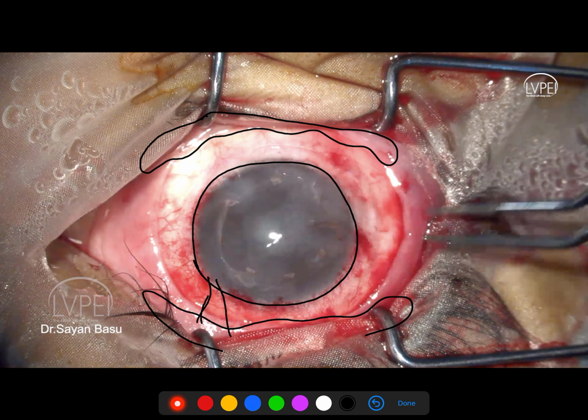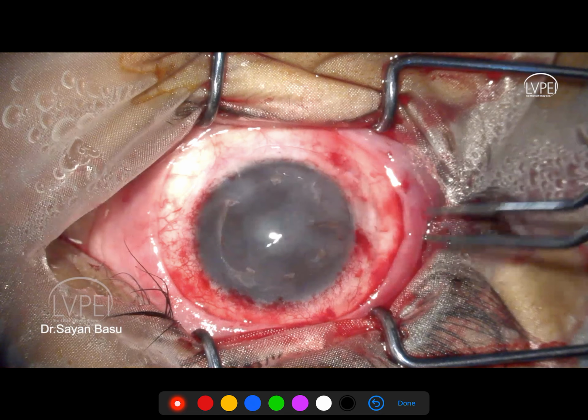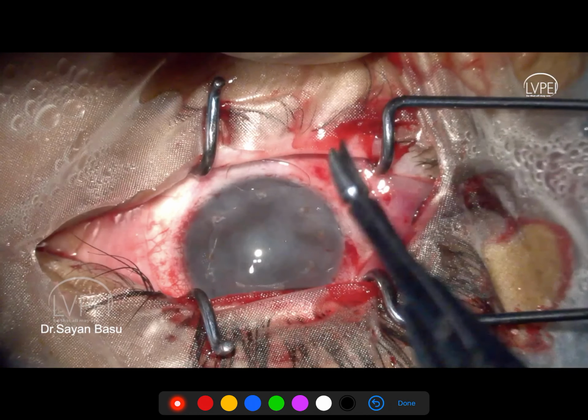So if you try to peel them off, you might actually start tugging at the sheet of glue that has the transplants. So make sure that when you are removing them, you cut these strands and you don't peel them when you are removing the speculum. This is the key and very final step.